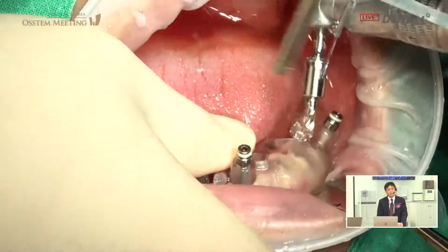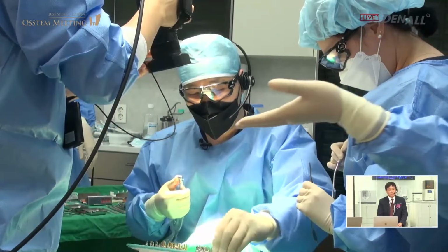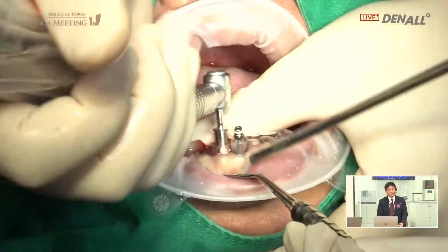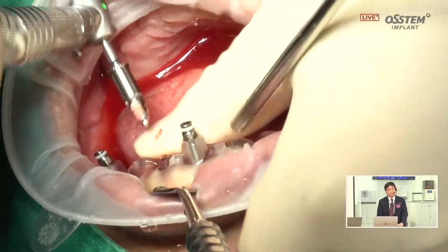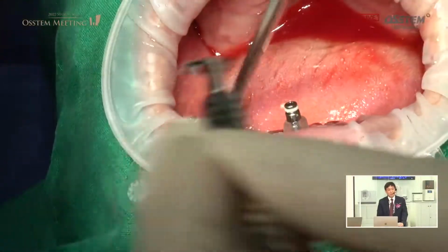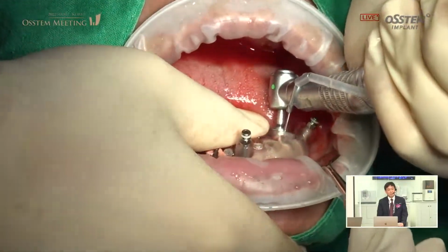My impression is that in the lower posterior, the bone quality is weaker compared with the anterior. That's the impression I get when doing the initial drill. In number 45, it's especially so.